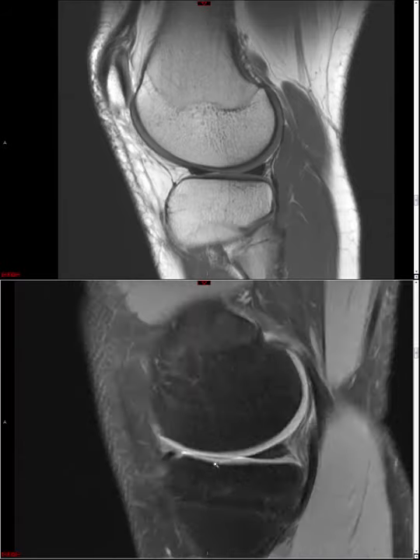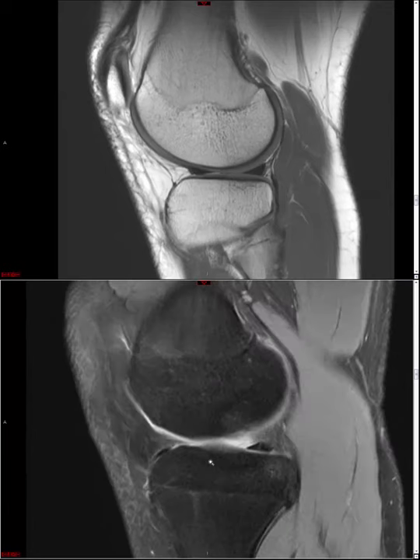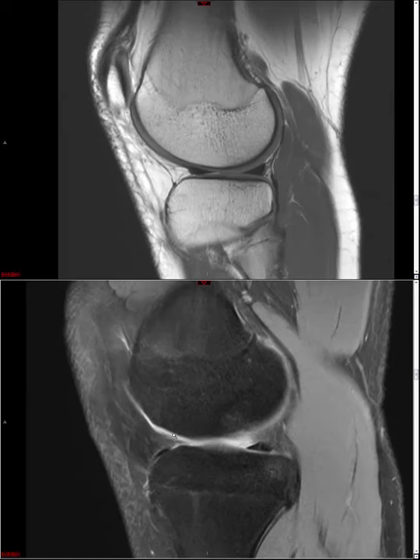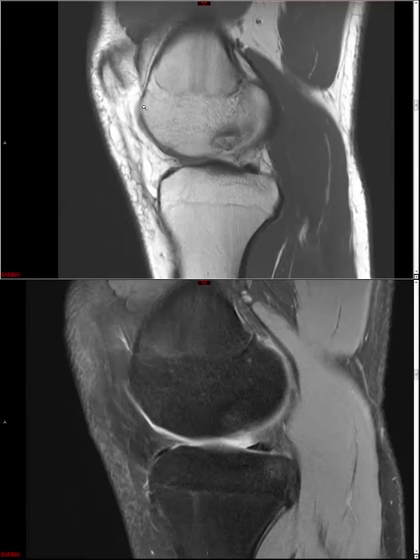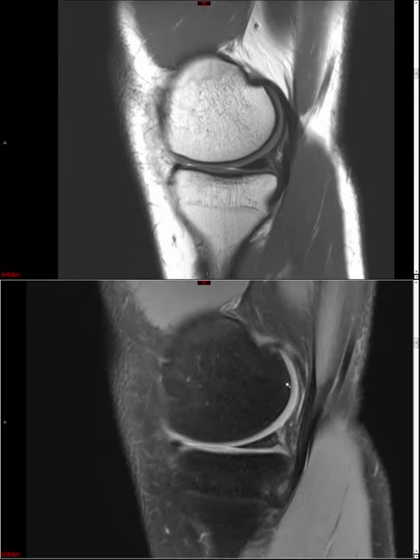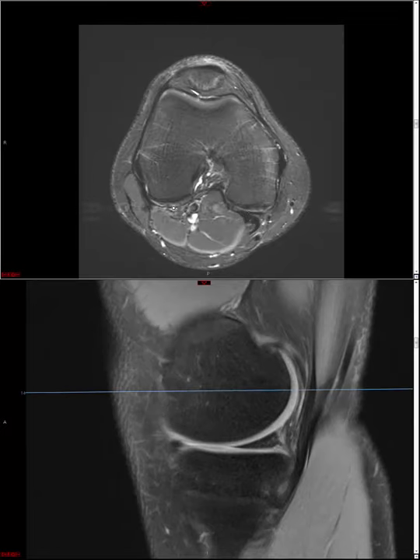On the medial side, you have a similar condylopatellar sulcus, but it's actually more anterior. It's at the junction of the anterior third and posterior two-thirds. Admittedly, again, very hard to see in this patient. See this focal flattening here? Anything here I would consider medial femoral trochlear cartilage. Anything back here I would consider medial femoral-tibial cartilage. Sometimes you'll see some pretty high-grade chondrosis way back here, posterior and non-weight-bearing. I would describe those still, but of course, less clinical significance one would think.